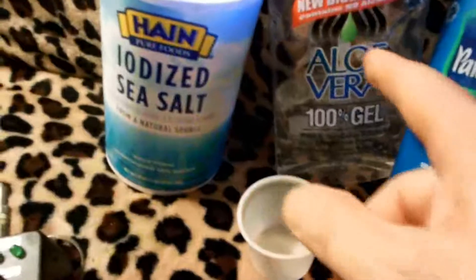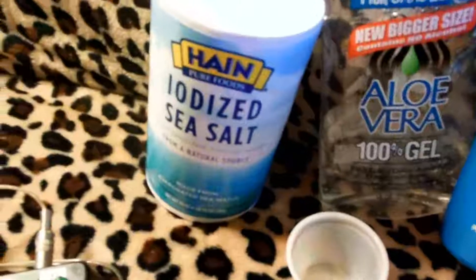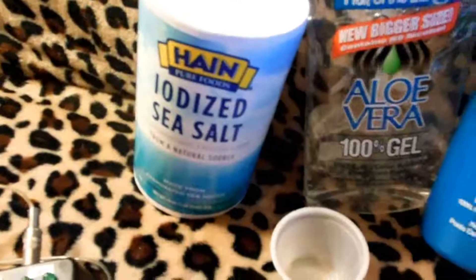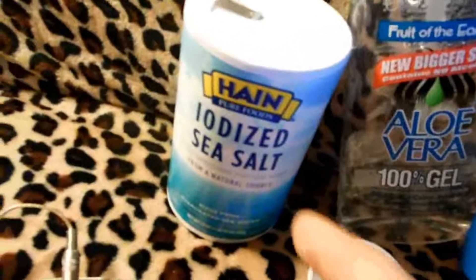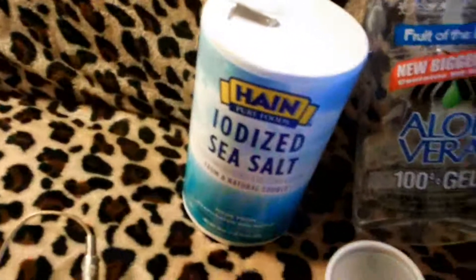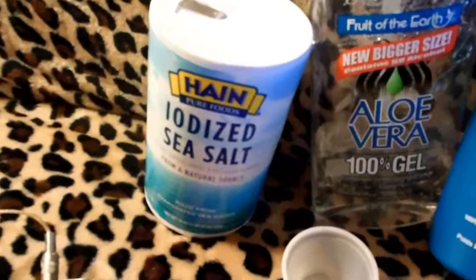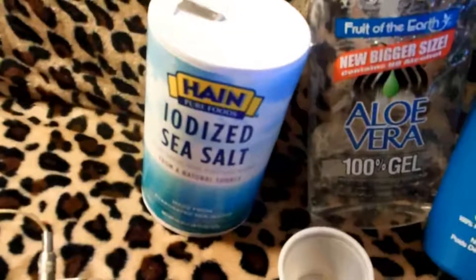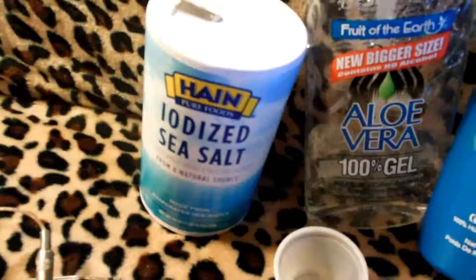Electrode gel is $3 an ounce — you can just make it. Aloe vera, coconut oil, with sea salt. Mix them together. There is no exact perfect mixture — you don't have to measure it out. Just put a good amount of salt. Mix these two 50-50, put a good amount of salt in it, mix it up, and put the electrodes in there. They will stay conductive, it will protect your skin, it will not dry out, and it will stay conductive all night. So that's what you want to do — it's a cheap, cheap way.